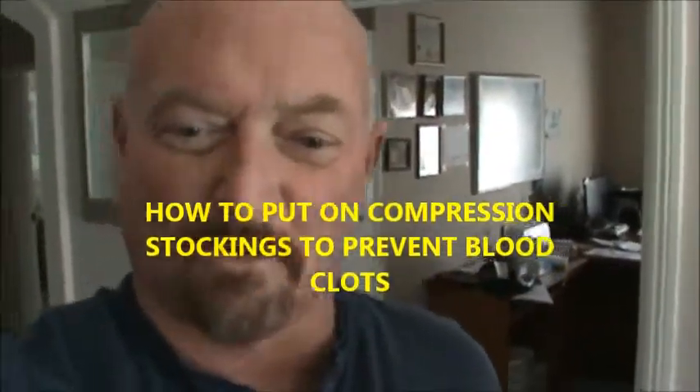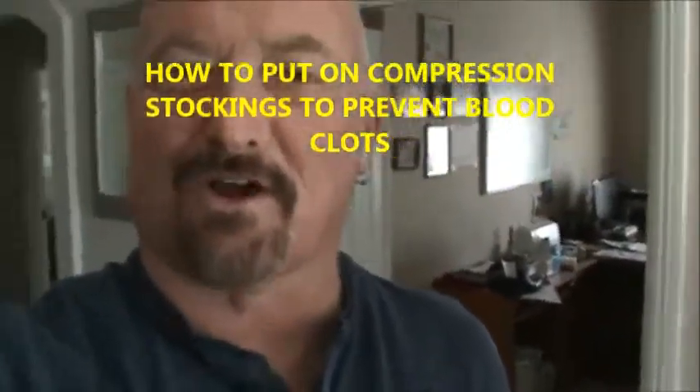Day 11. This is how you put on support stockings, or compression stockings — TED hose, whatever you want to call them. We got the professional right here.